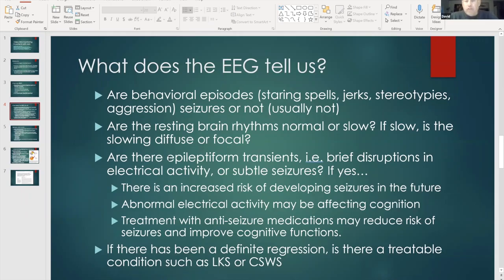Every once in a while, we'll see a patient who has either subtle seizures or subclinical seizures. Another term for that is electrographic seizures, electrical seizures that have no physical manifestations. Oftentimes the child may be in therapy, playing around the house on an iPad, and I will see a 10, 15, or 20-second electrical seizure, but there's really no physical manifestation of that seizure. So these are quite important to pick up, and they're more easily picked up on a long-term video EEG study. And the reasons are listed below.